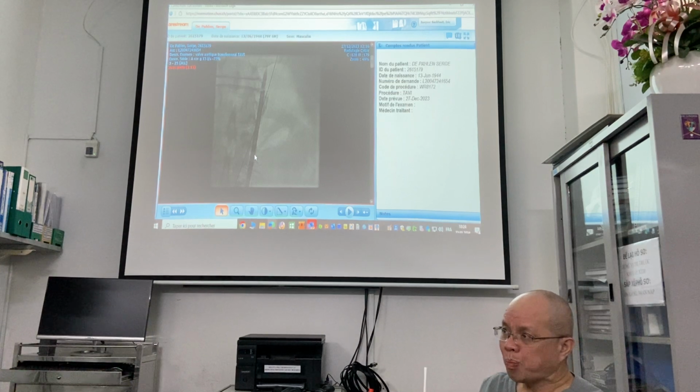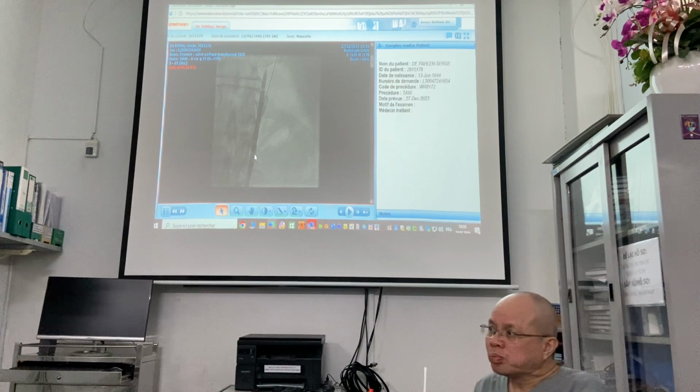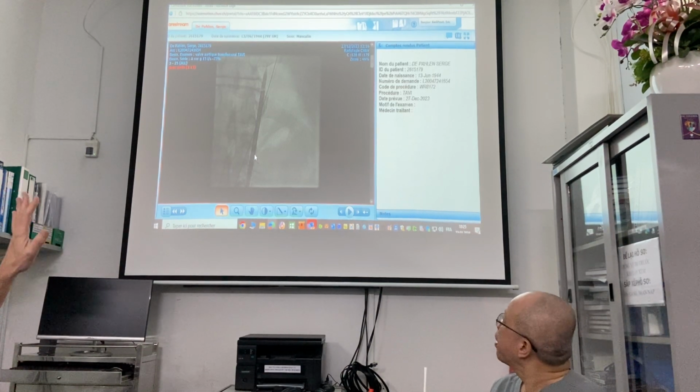We need a CT scan in every TAVI patient. The reason is to see if we can go from the femoral, because we need at least 5-6 millimeters of lumen. We need to see the plaque composition, all that. We also need to see the size of the valve. We have a software to measure the surface of the valve, and depending on that you will use a bigger or smaller valve. The bigger the annulus, the bigger the valve. It's really important to have good measurements. There is a software that does that for you.